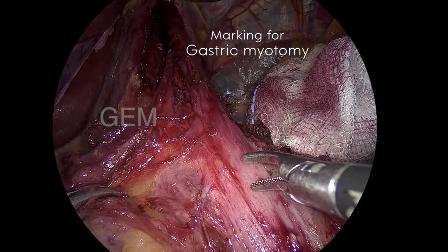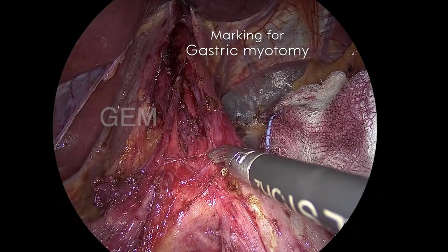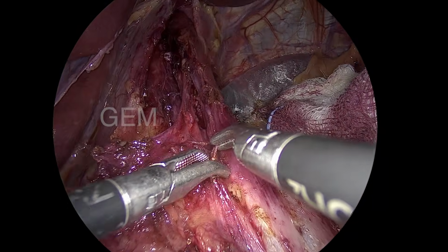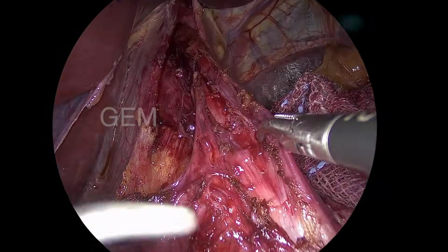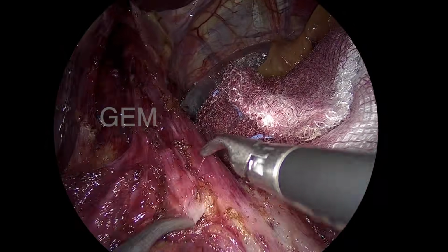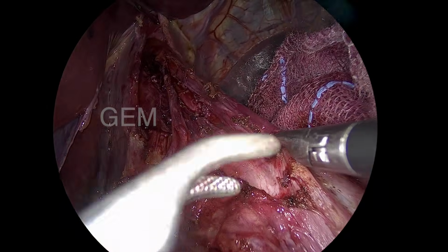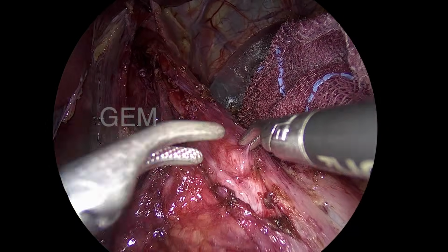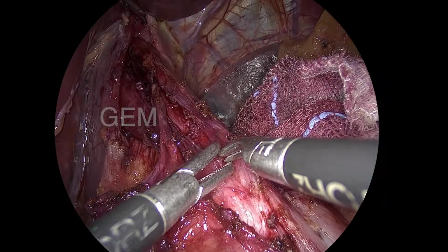Now I am marking the gastric myotomy on the gastric side, usually 2 centimeters or maximum 2.5 centimeters. I mark first, and then I start division of the fibers. Here there will be oblique fibers at the OG junction and gastric side. The OG junction is not much oblique, but the gastric side is very oblique, and most of the mucosal injuries in the series happen on the gastric side rather than the esophageal side, because the gastric mucosa is very thin and you have to be very careful.